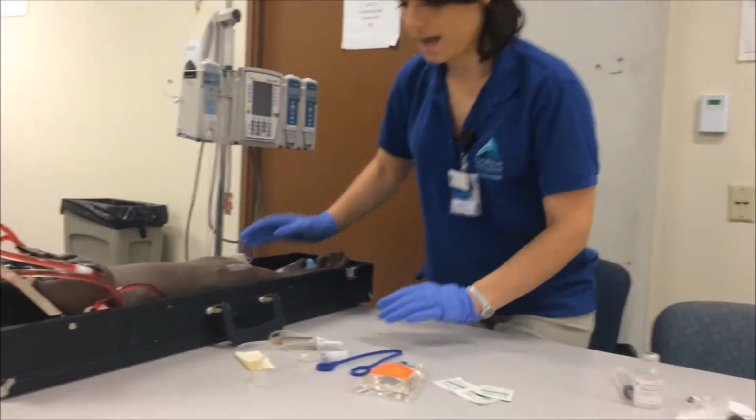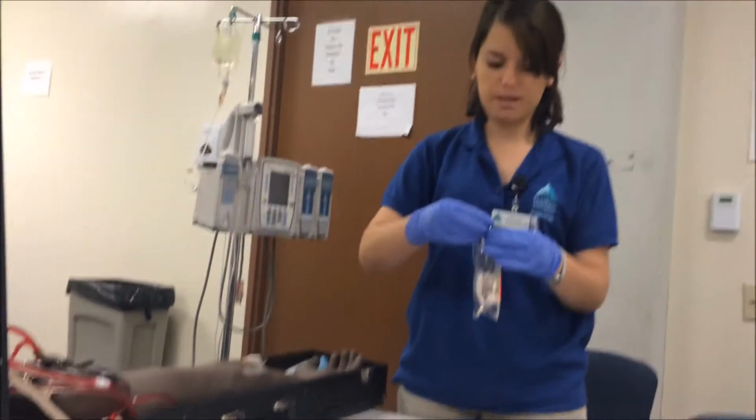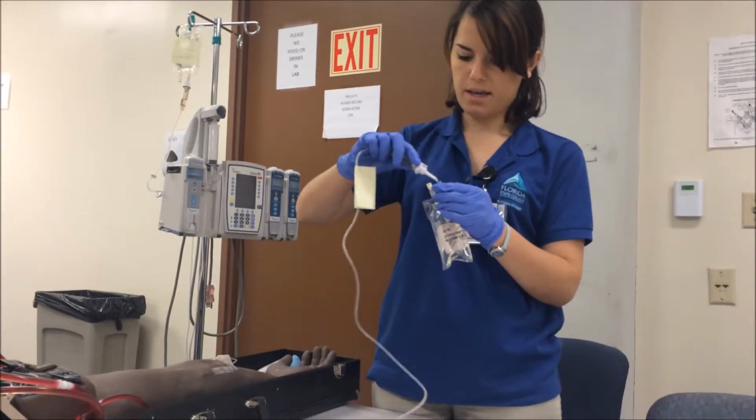So now I'm going to go right ahead and prime my tubing. So I'll go ahead and spike my medication.